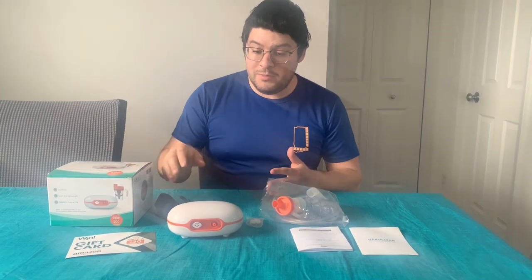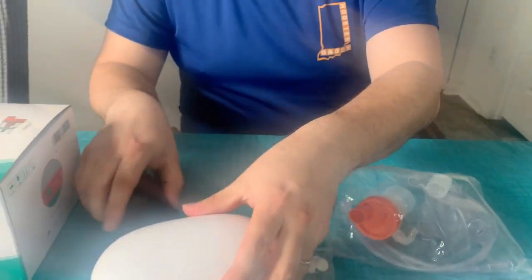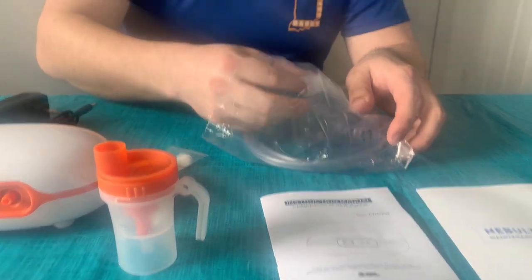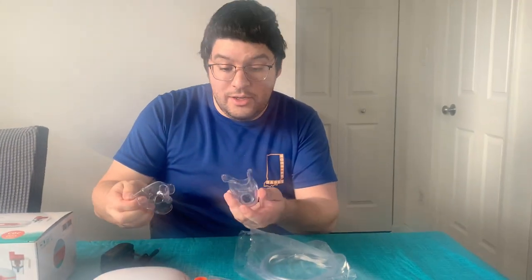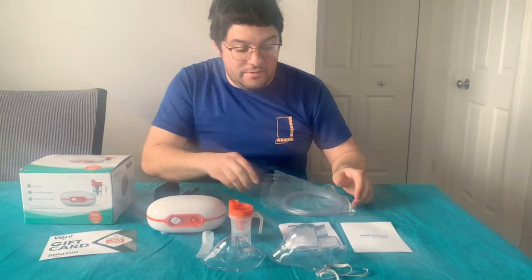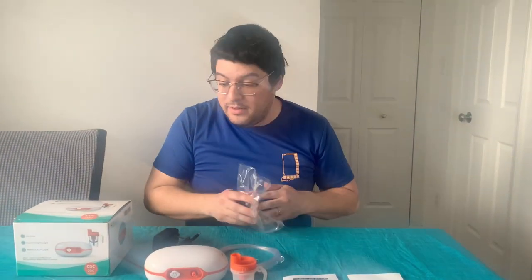So let's go over first all the stuff that's in the box. Of course we have the nebulizer itself, very small and very portable. We have the power cord, a set of five air filters, our medicine cup or liquid holding cup, the mouthpiece, an adult and child size face mask along with their elastic bands. And of course we have our tubing.